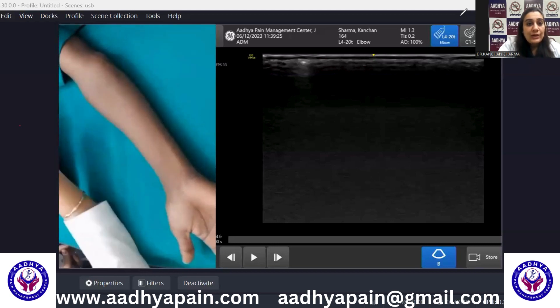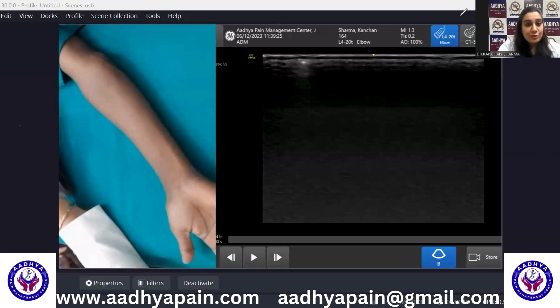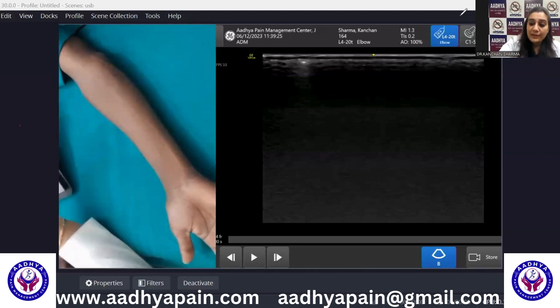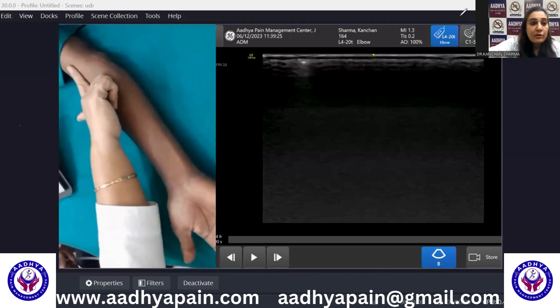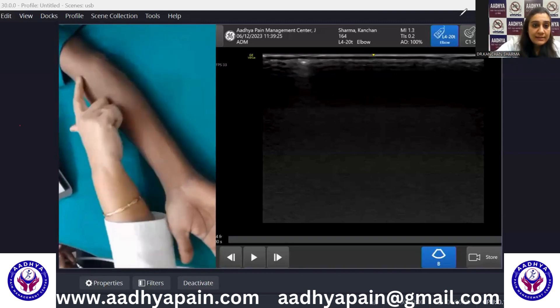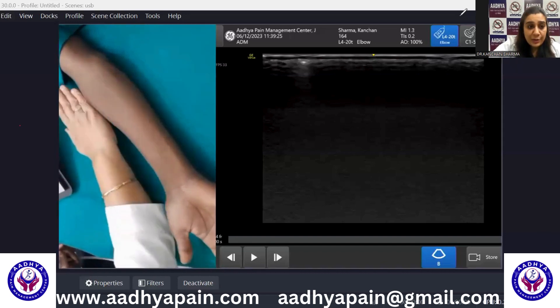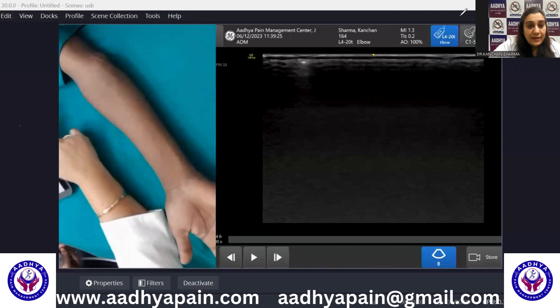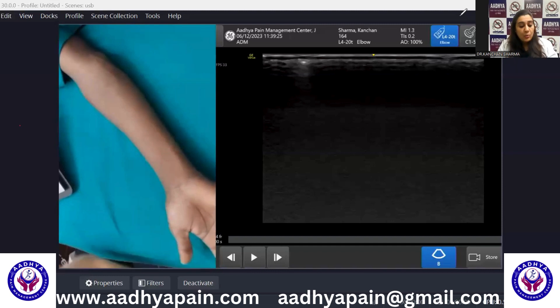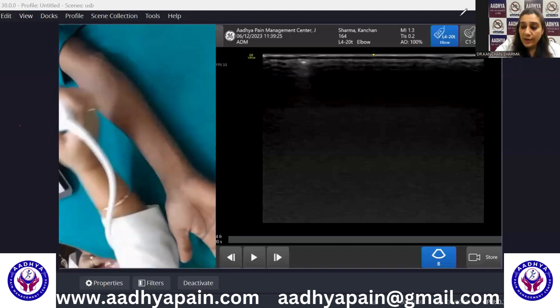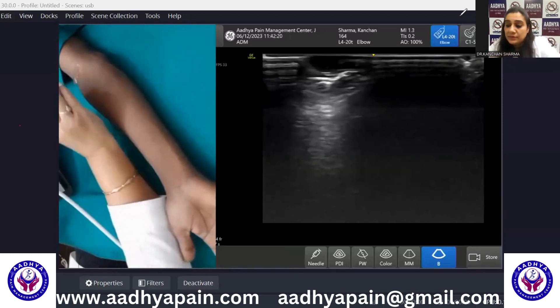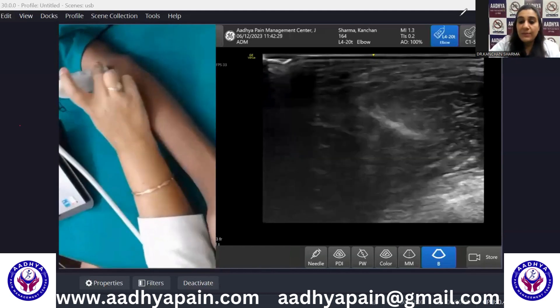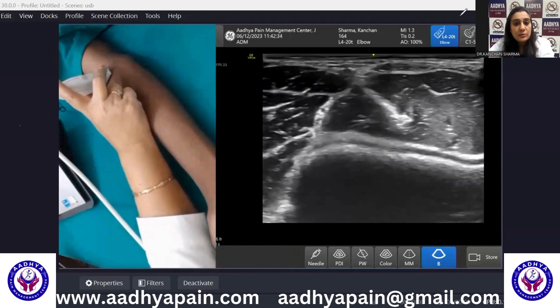The target point is the distal articulating end of the humerus, which comprises the capitulum and the trochlea with articular cartilage lying over it. The probe is placed in short axis to the distal humerus with the aspect marker towards the lateral side.